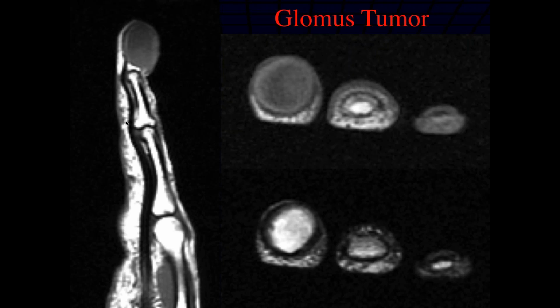Yes. And in this location, this is typical of a glomus tumor. But those are two things to think about. In this location, a glomus is by far the most likely.